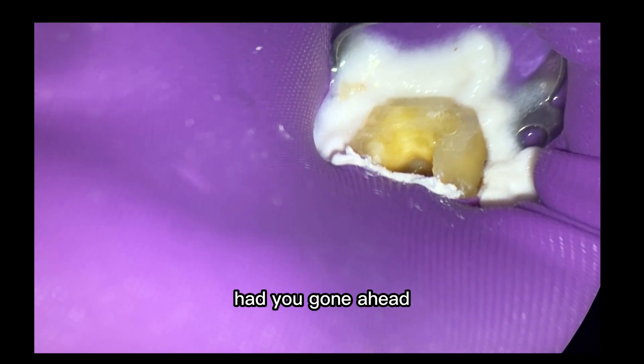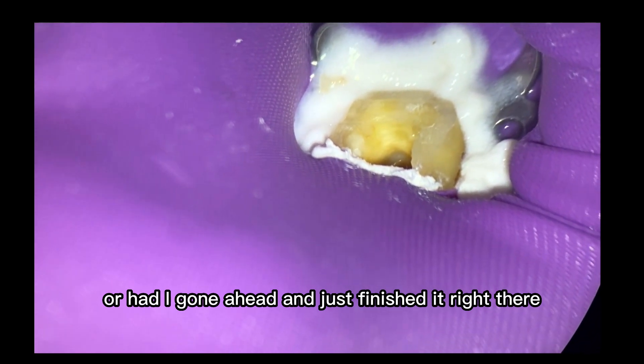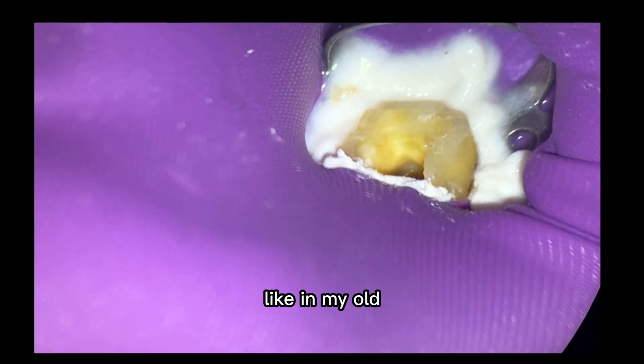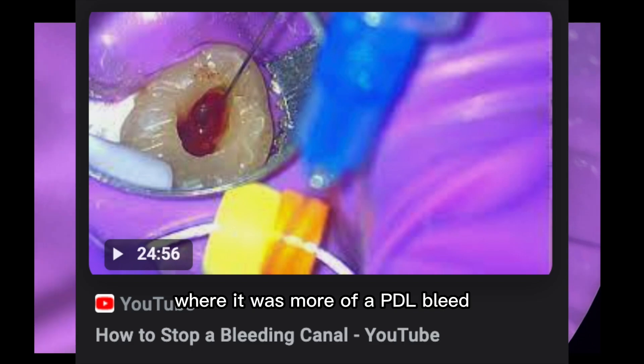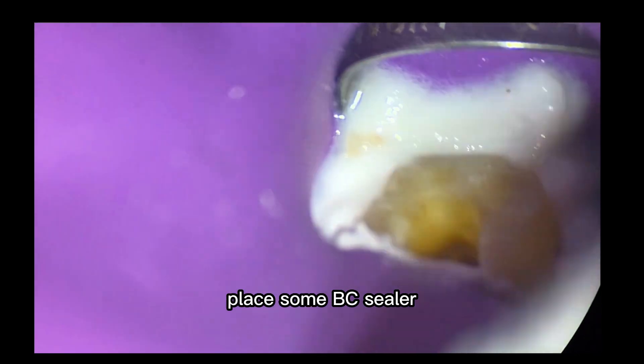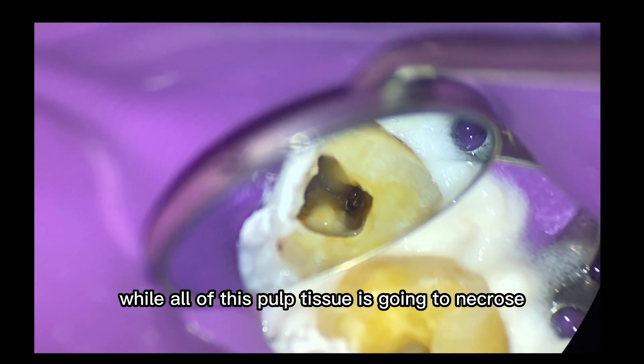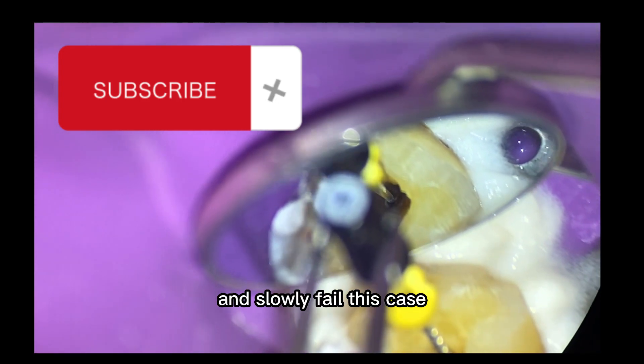The thing is that had I gone ahead and just finished it right there — like in the other video where it was more of a PDL bleed, had I forced the issue, placed some BioCeramic there, got maybe some hemorrhage control, hemostasis, and then finished the case — all of this pulp tissue is going to necrose and slowly fail this case.